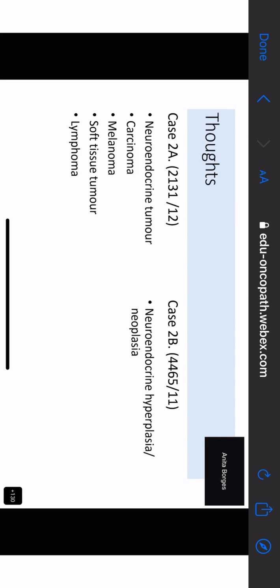It's very, very unlikely that you will get a carcinoma and melanoma, leaving the mucosa absolutely intact, unless it is creeping from somewhere else and coming into the part of the stomach that has been biopsied. Okay? So those are our thoughts.